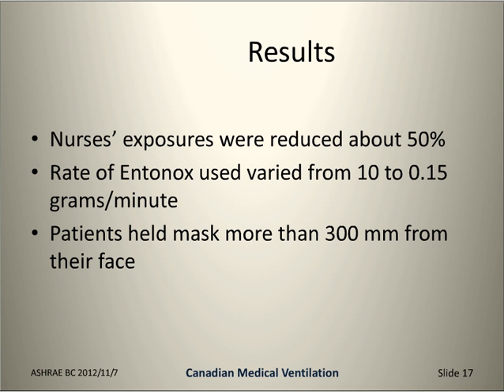The nurses had told us that some patients would go through a whole cylinder of nitrous and halfway through a second one, others would use very little. Individual variability is significant as far as the patient's concerned.